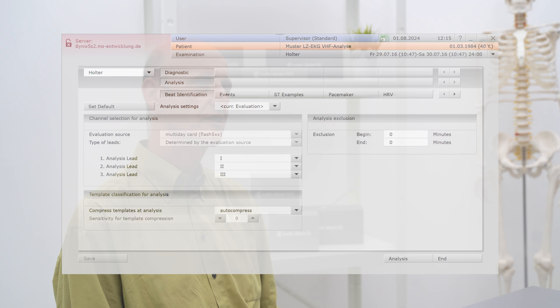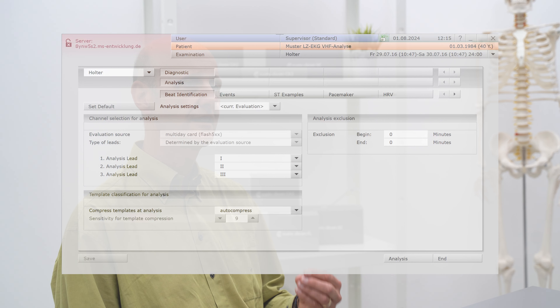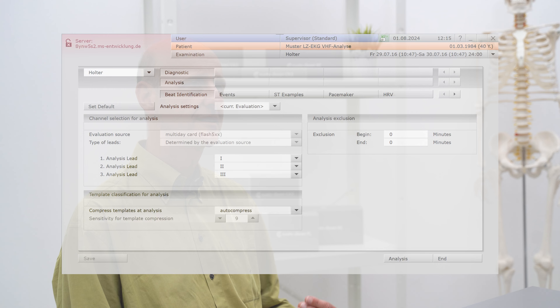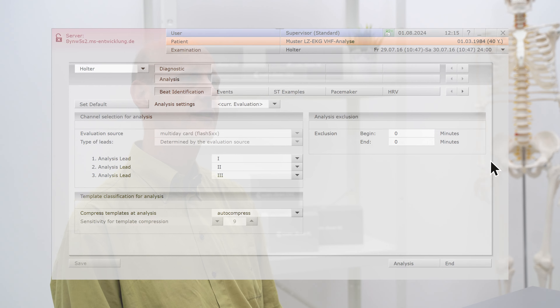In addition, it was possible to switch an artifact filter on or off. All these functions are no longer available in Custo Diagnostic version 5.9 or higher, because they are no longer needed, as the ECG analysis supported by the neural network simply does a very good job.